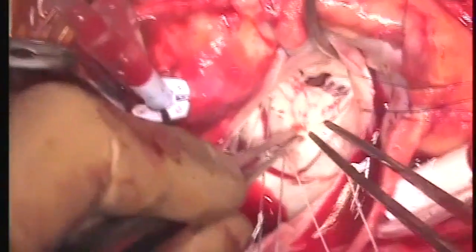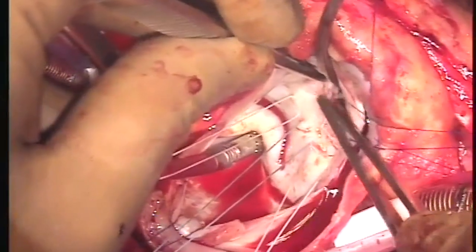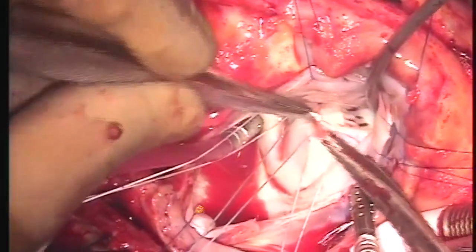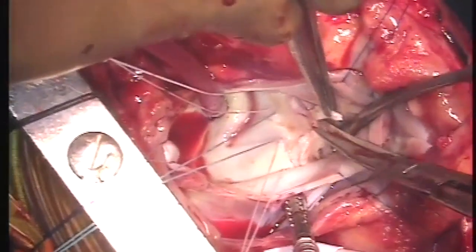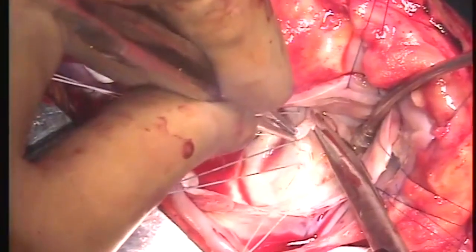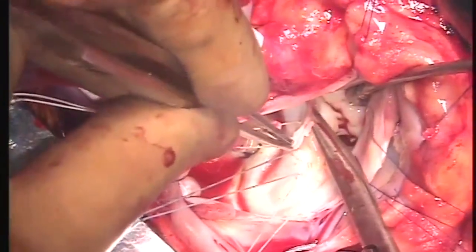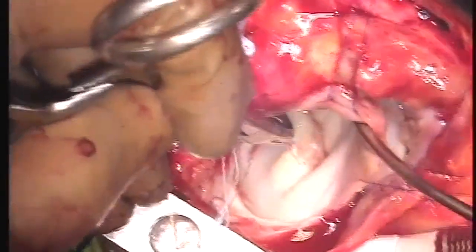The peeled segment is cut off from the PML at the rough zone. Now the saline testing is performed, which you can see that the mitral valve is competent.